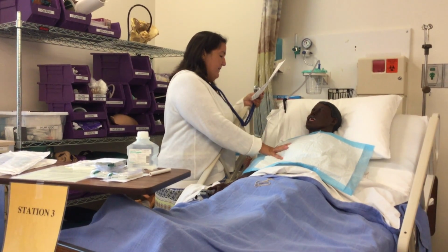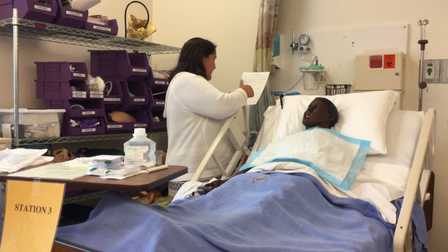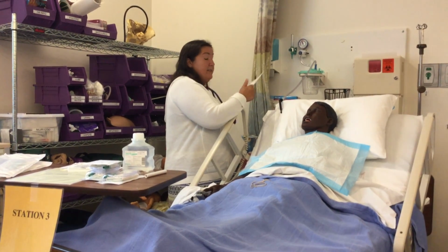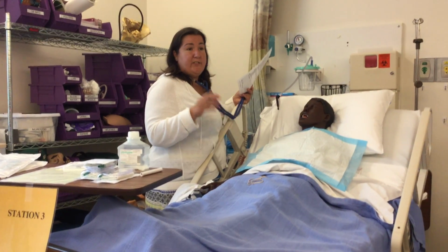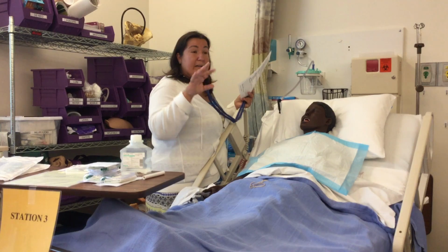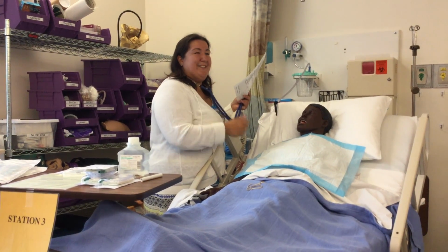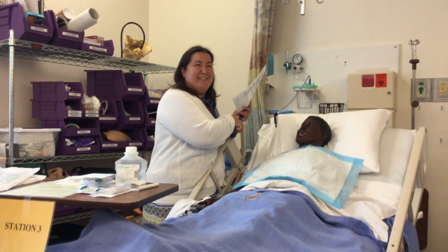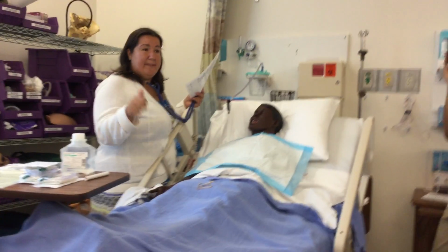You want to put the pad on them, and you're going to turn on your suction depending on your patient. You want to put it on continuous suctioning because you're going to do intermittent with your finger. You don't want intermittent suction, because intermittent suction, like when we learn NG, sucks, gives a break, and then sucks. You don't want that when you're suctioning, because you don't want to go in and find out it's not sucking right then. So you're going to do that with your finger, by moving your finger on and off the suction catheter. That's going to control it.